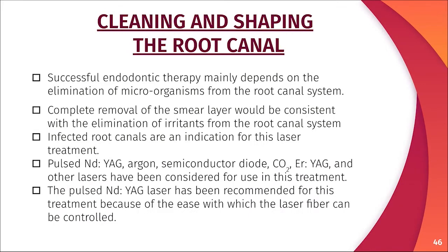We all know the success and prognosis of root canal therapy depends upon the elimination of microorganisms from the root canal system. If the microorganisms are not eliminated properly, it will result in the failure of endodontic therapy. So, infected root canals are an indication of laser treatment. We use pulse Nd:YAG, argon, semiconductor diode, carbon dioxide, erbium YAG, and other lasers have been considered for use in this treatment. The most recommended one is pulsed Nd:YAG laser because of the ease with which the laser fiber can be controlled.